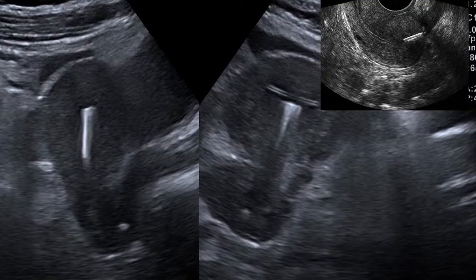So you can see these are the arms. Let me show you the arms. So what we have here, these are the arms of the IUCD. You can see they are fully extended there. So that's the stem of the IUCD. So it should be centered.